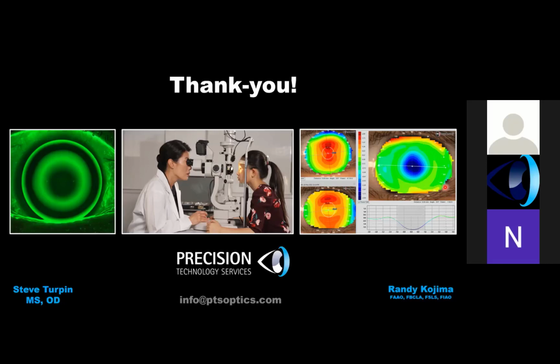Basically, I think we covered the most important points. What we had left to talk about centered around the fact that we know the story and why a smaller treatment zone might be better for our pediatric patients. What are the details about starting that? As you said, you can use either the Moon Lens or the B-free.